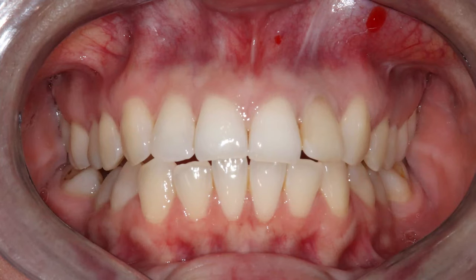At Matrix Dent Specialist we use 3D X-ray, which allows us to see all angles around the tooth, accurately measure the dimensions and nature of the lesion, and determine the possibility of restoring the tooth non-surgically. In this particular case, the patient had a swelling on their palate that persisted for quite some time. She had visited a dentist, but because of their two-dimensional X-rays they were unable to see a large lesion present on the palate side of the tooth, leading to continuous drainage of pus, persistent swelling and pain.